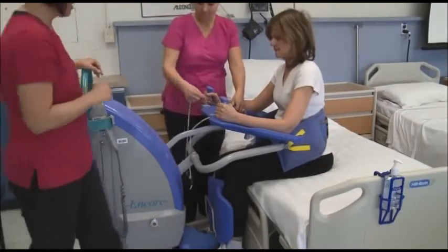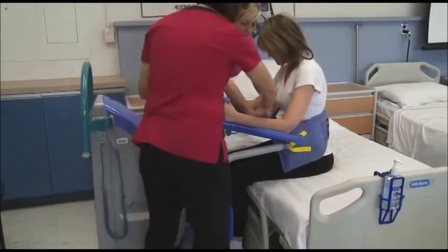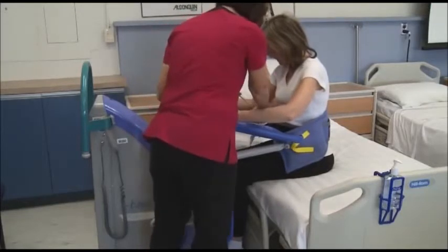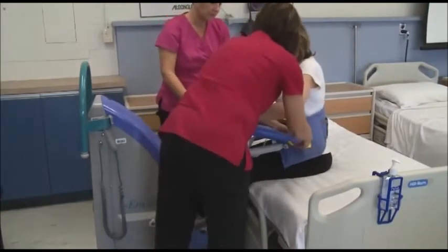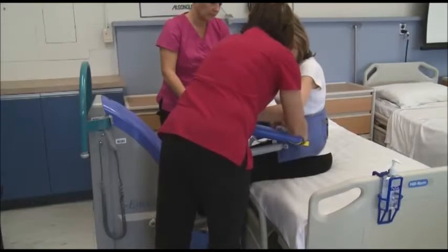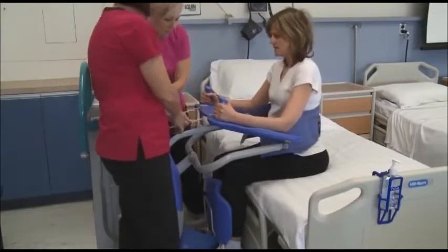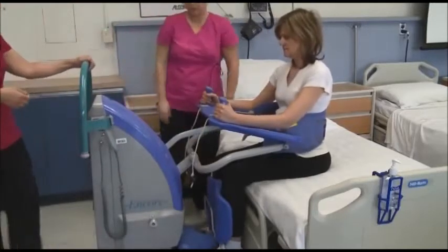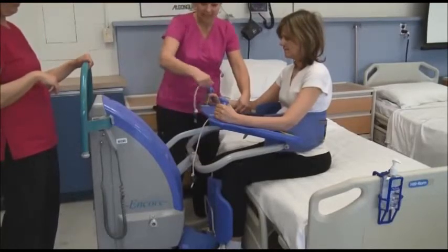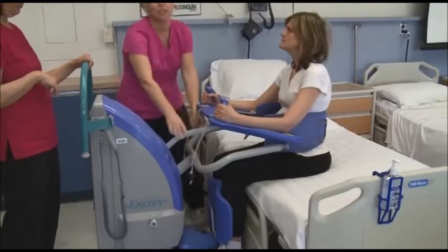Okay, the next component with our brakes on is we're going to secure the strap. And these straps are held in by little teeth, so we loosen them. And then pull taut so that she feels supported and that it's done evenly, and Tracy's doing that now. So where we're pulling, there are teeth integrated here, so in order for us to release the tension, we must lift up on the rope to disengage the teeth. When we're putting it into place, we're pulling and pushing down to engage the teeth.